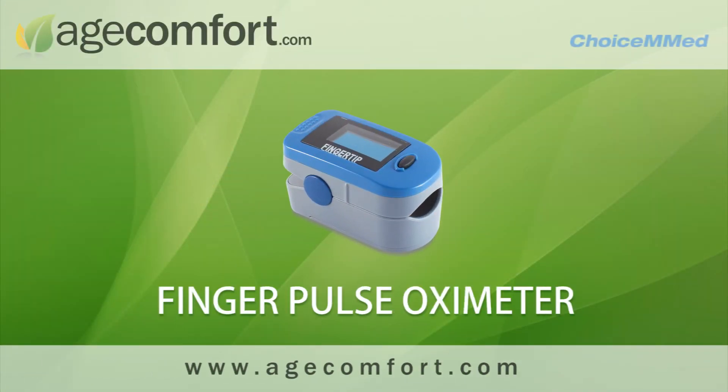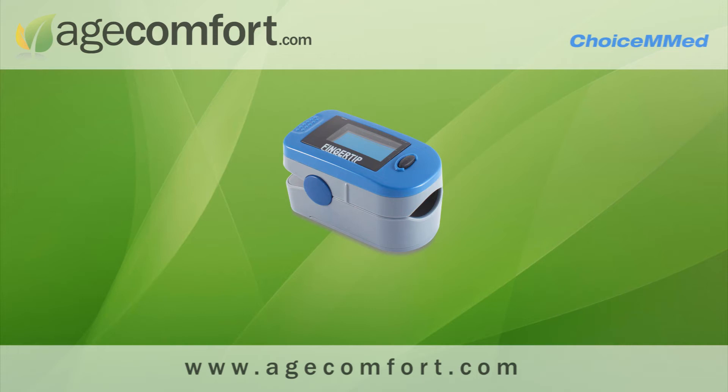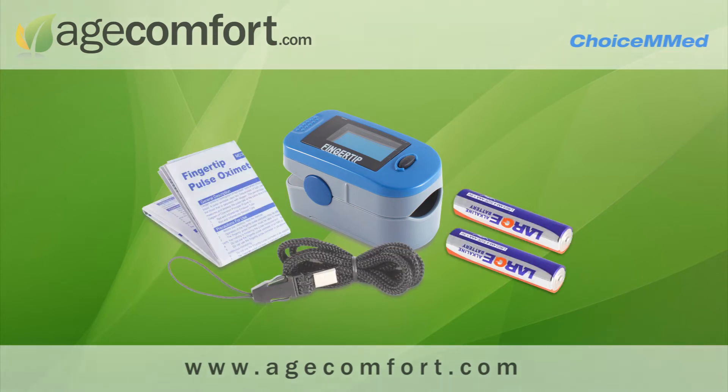The ChoiceMed finger pulse oximeter is used to measure heart rate and oxygen saturation in the blood. Our pulse oximeter comes complete with a neck lanyard, two AAA batteries, and a complete instruction manual.